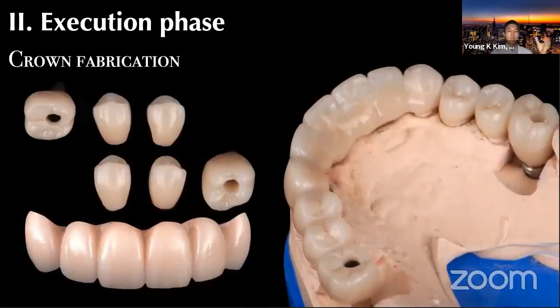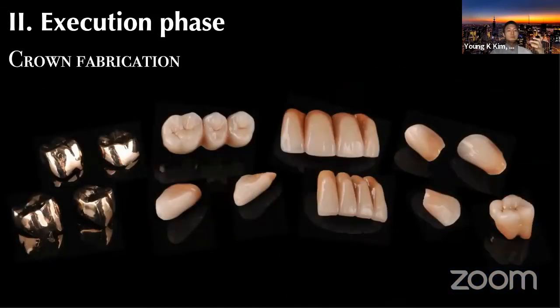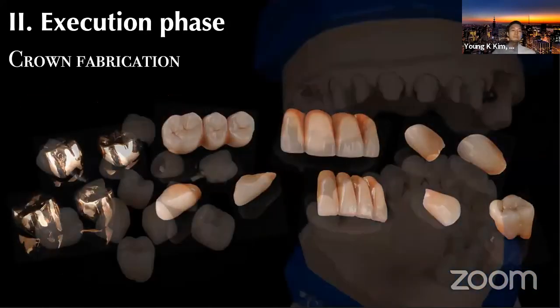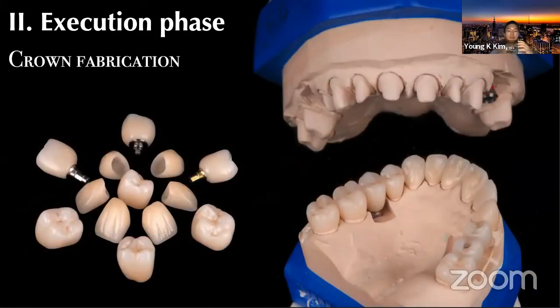If it's a bridge, I prefer to use a PFZ bridge, porcelain fused zirconia, on the anterior, and with the proper cutback by the laboratory it can be a very good option, and monolithic zirconia on the posterior. We still do gold crowns and PFM bridges, depending on the indicated cases and the patient's preferences, because they have the longest track record in the clinical literature. So I still do such restorations, but most of the time we do the milling, more on the E.max crown, zirconia, porcelain type of processes.